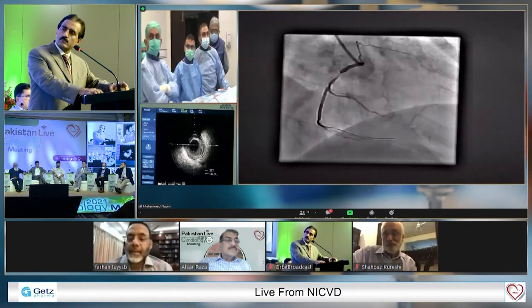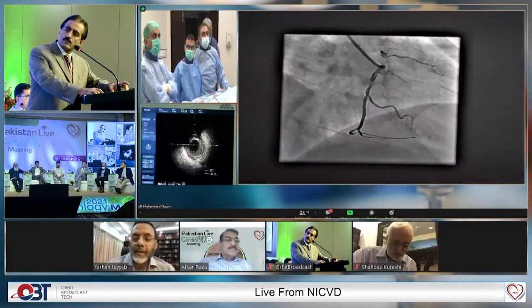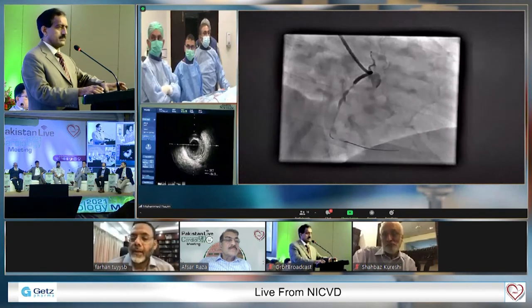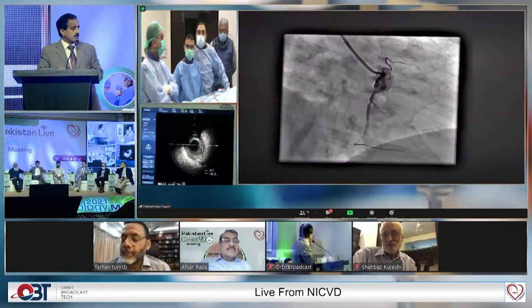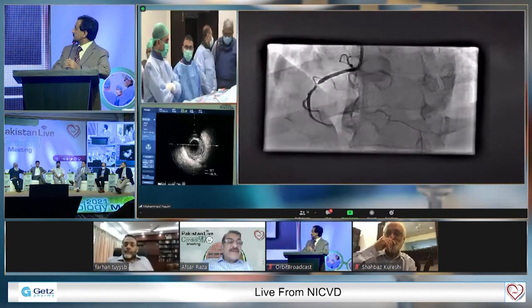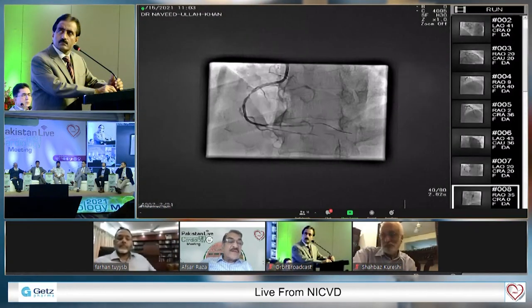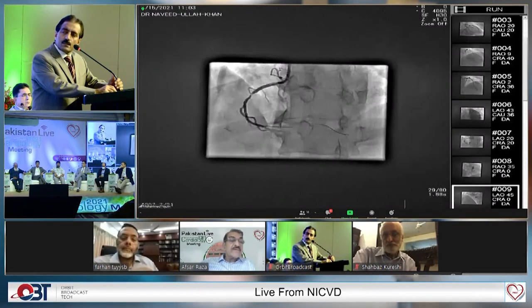I will request the panelists to please guide how they will plan this angioplasty. This is an acute situation, and on the angiogram there is a total occlusion of the right coronary artery. How will they plan this angioplasty? Please, I need comment from the panel. Dr. Afzal Raza, please. Yes, I'm not seeing the larger screen, but it's a total occlusion acute MI, so we have crossed the wire, and we will see if there is a thrombus burden, then we can decide whether to aspirate or not, although it is not strongly recommended.